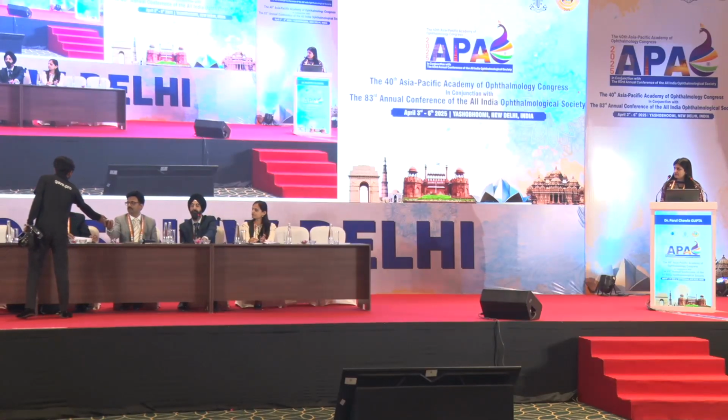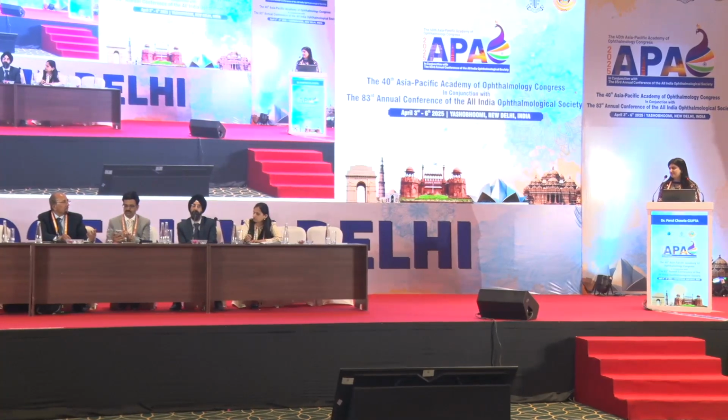I think as far as three-piece versus single-piece is concerned, initially we used to implant three-piece mostly. Now we are implanting more of the single-piece IOL. But as such, there is no change in the PCO rate when it is a square edge type of IOL, hydrophobic acrylic square edge type of IOL. There are still many US surgeons who still implant three-piece IOL. But as such, I think there is no change in the complication rates.